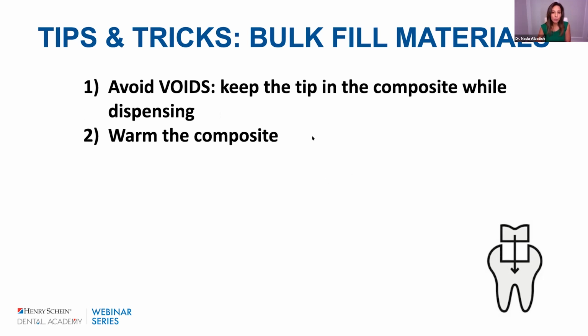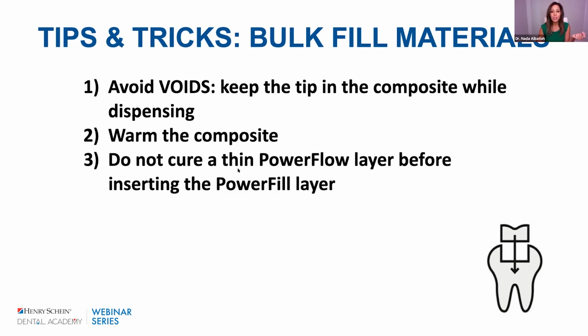This has been incredible and life-changing for me: warming the composite. You absolutely do not have to do this. It is not part of the manufacturer's instructions. However, for all the composites that I use in my office, I love warming the composite. It makes everything more flowable, and that means that I'm less likely to get voids, right?